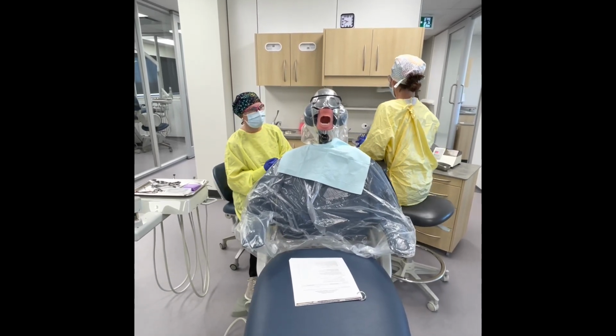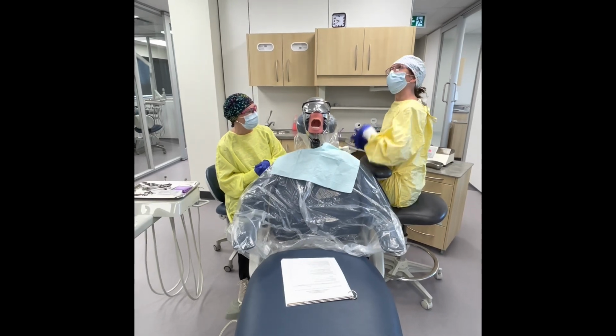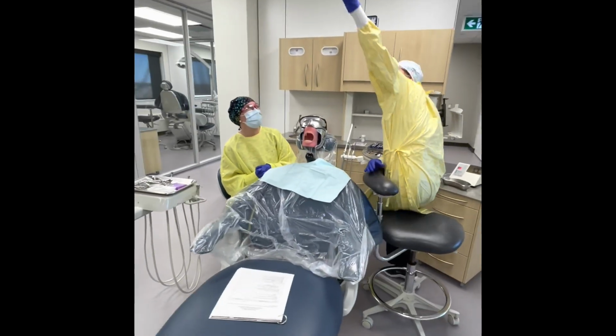Your operator will tip your patient back, or your client back, for you. You can bring the light down.